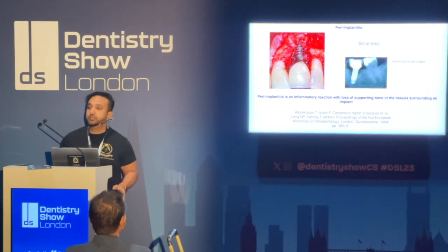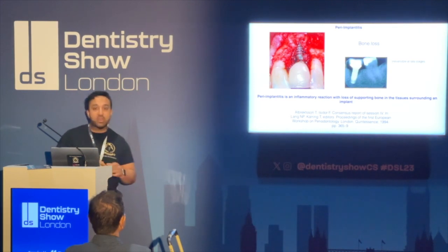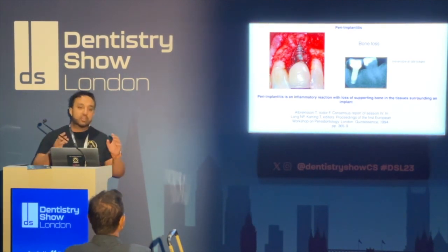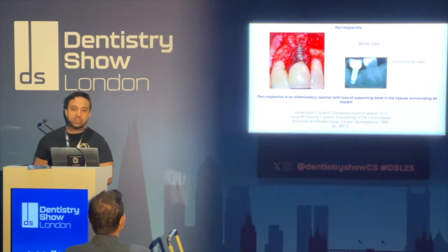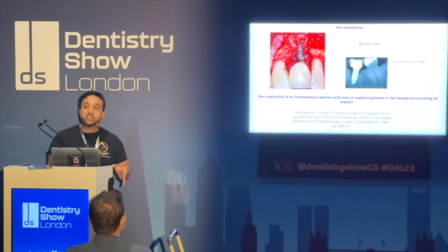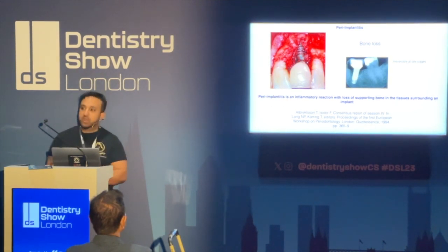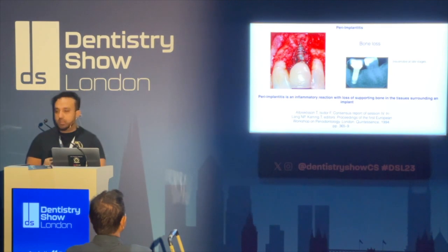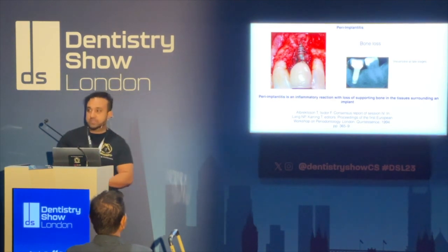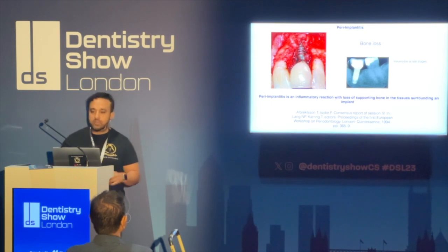Implants are an elective procedure. If you've got active perio, one of the consent issues that I do is tell patients that you've had perio before, you've lost your teeth, you're highly susceptible to perio on your implants. And implants need more care than natural teeth to be looked after. Better oral hygiene, more frequent hygienist visits, better interdental cleaning, use of adjunctive mouthwashes. Yeah, we use Curacept implant, a specific type of chlorhexidine around that.